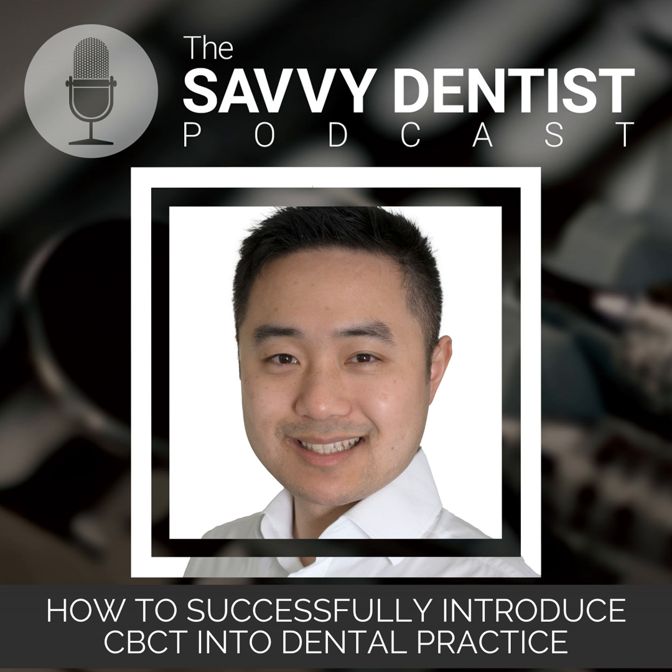To understand that, CBCT will certainly have a lot of benefits in terms of your practice, but do be cognizant of, one, radiation. You still want to make sure you're reducing radiation dose for your patient. So control the field of view, and if you don't need a 3D image to change that management, don't do it. And if you do it, make sure that all of the data image set is interpreted, because the last thing you want is to not be able to sleep at night because you missed a big pathology and a bad outcome happens for the patient.